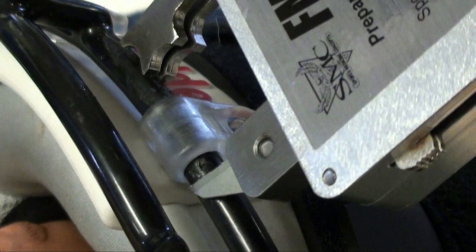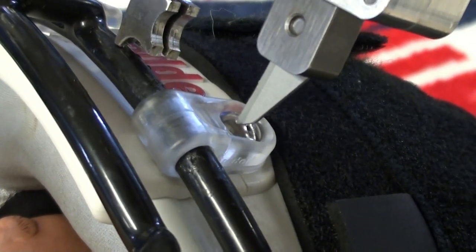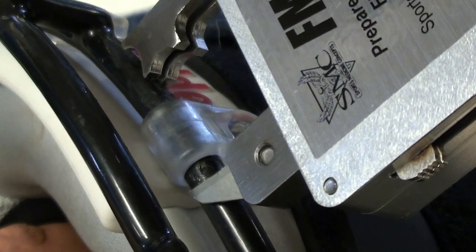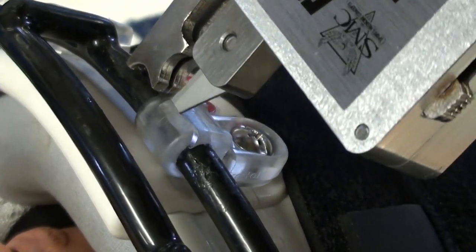Rather, click the release lever to open the FM Extractor and reposition it by resting the superior notch of the anvil on the face mask bar. Reach the blade across the fastener and make a second cut that will result in a one-half inch piece of the fastener falling away. This gap will provide enough space for the face mask to be removed.